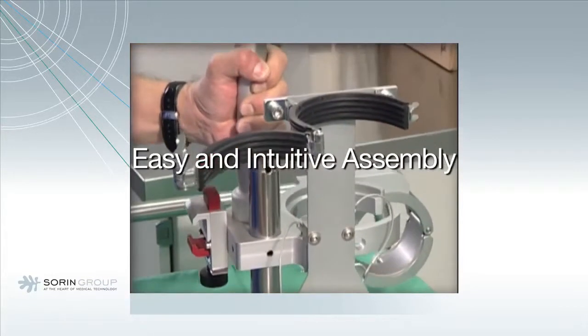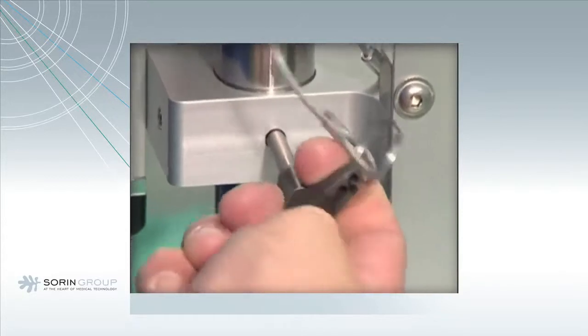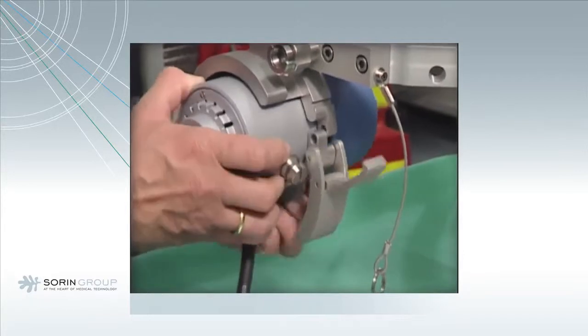Also, secure the holder on the upper hole of the mast with a splint pin. Place the motor to the holder and secure it with the bracket and the splint pin.